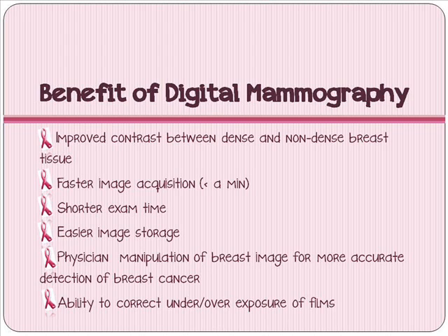And this digital mammography also provides easier image storage. Since the image is digitally stored, it can also be sent or transmitted electronically anywhere without loss of information. The storage space is also reduced, as there is no more film room. The physician can also manipulate the breast image for more accurate detection of breast cancer.